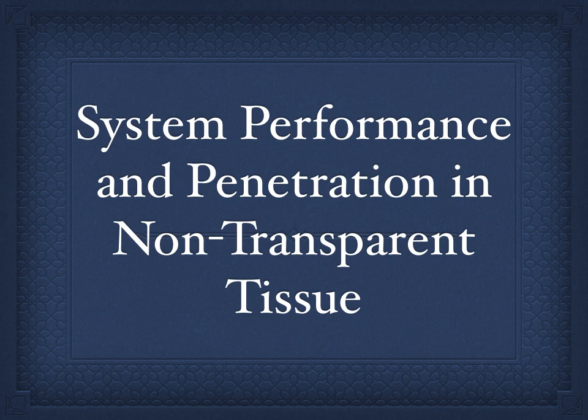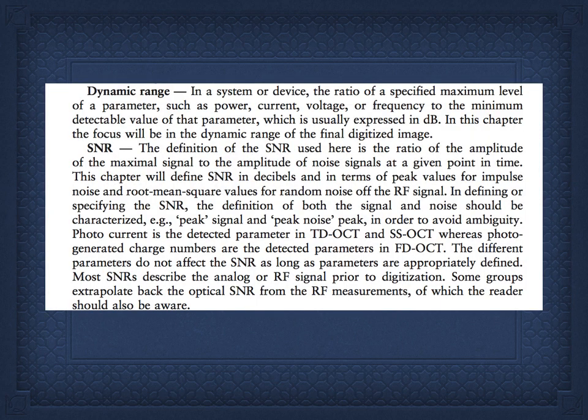And a lot of what we learn is from other fields, and the people who've done this extremely well are the people who work in the discovery of gravitational waves. You've probably seen that on the news, the detection of gravitational waves. These people have done incredible jobs in reducing noise below the quantum noise limit. And it's not violating quantum mechanics, but I'm not going to go into the theory of how that works here. So you can read about signal to noise ratio, SNR, on the slide, or dynamic range. I'm not going to go into that in detail.